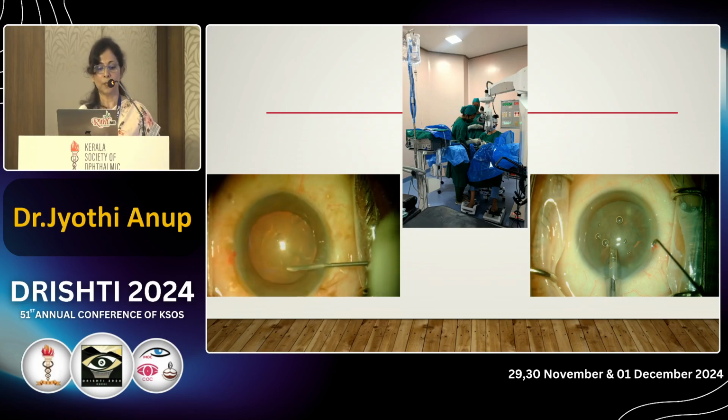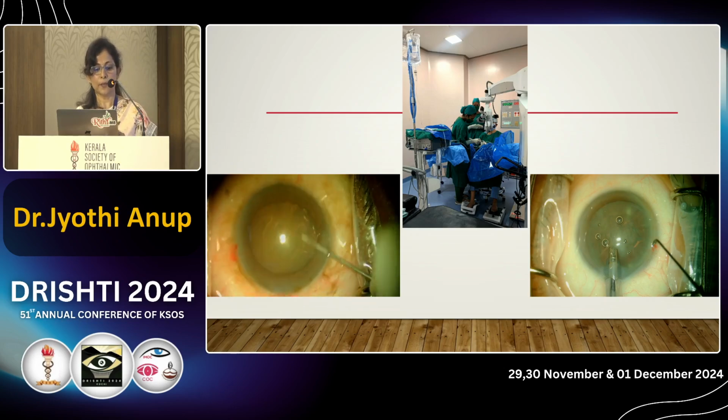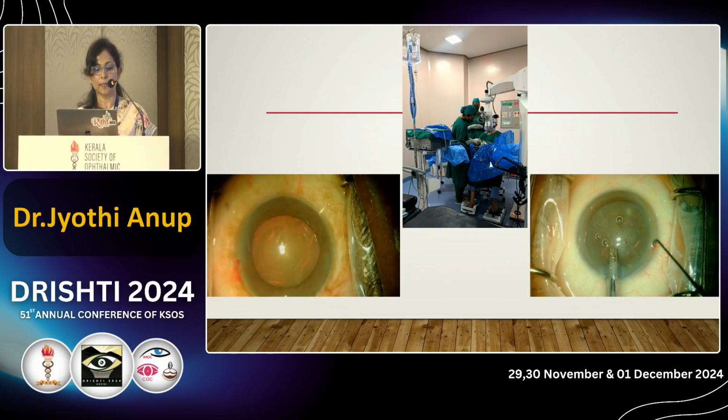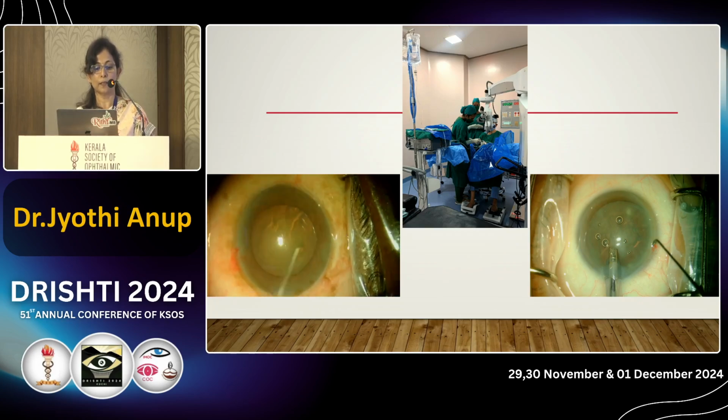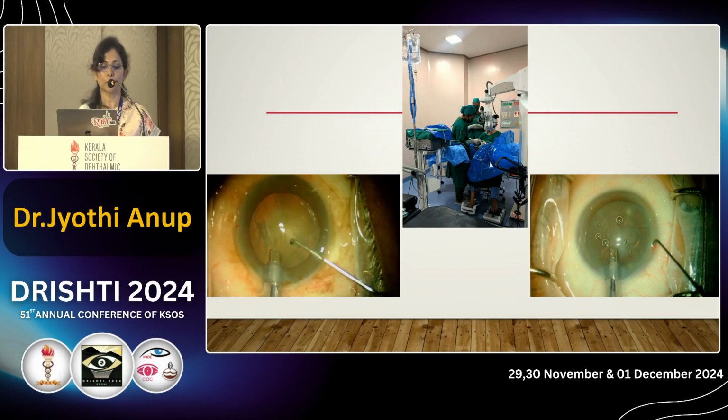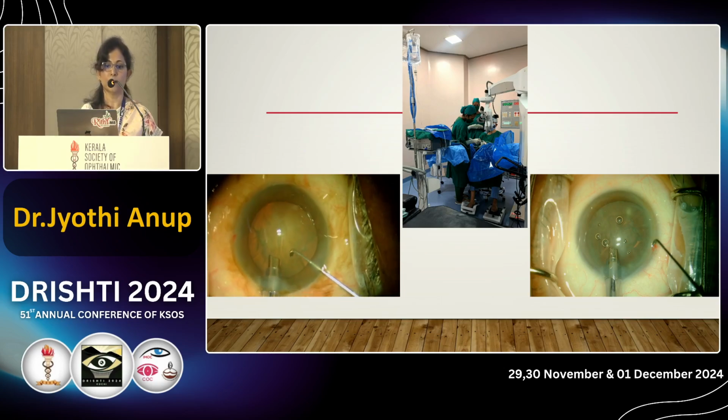And after the optimal rhexis, this is a point I wanted to stress, you have to decompress your chamber slightly to do a good hydrodissection. Observe for the fluid wave. And if your hydrodissection is not good, you won't be able to rotate. You can rotate the nucleus 2-3 times before even starting.